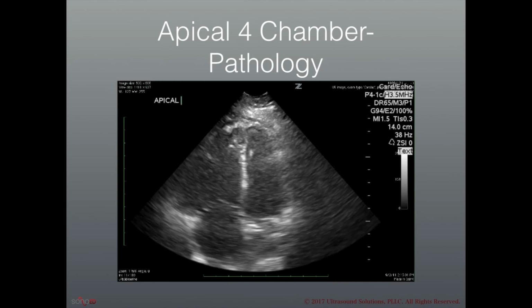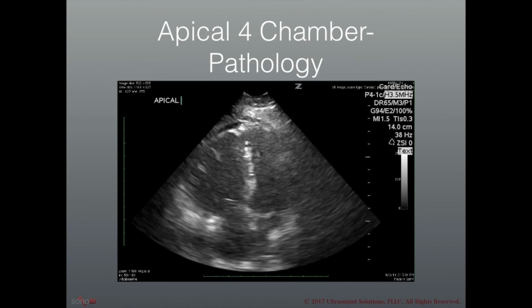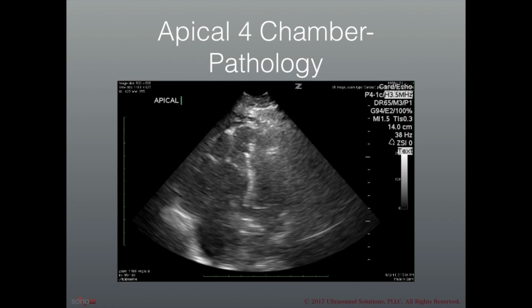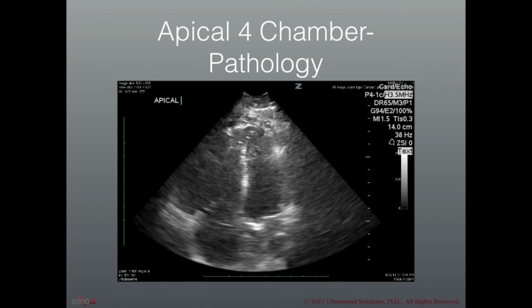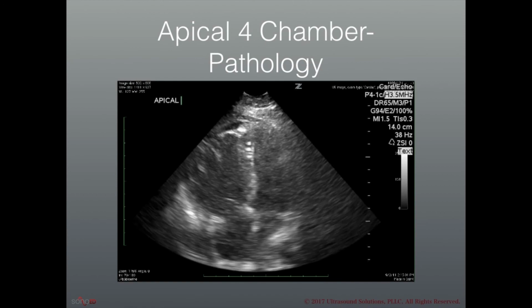Now, one thing to bear in mind that I often get asked by learners is, why does it matter that I orient the probe correctly on the patient? Is it really that big a deal if the probe is flipped and the image is obtained in reverse? My answer to you is exemplified here in this image. This image was obtained correctly.